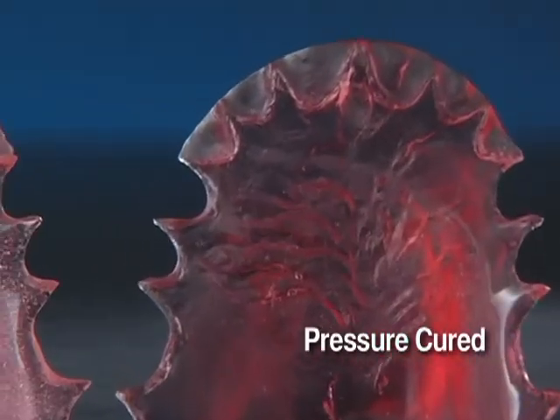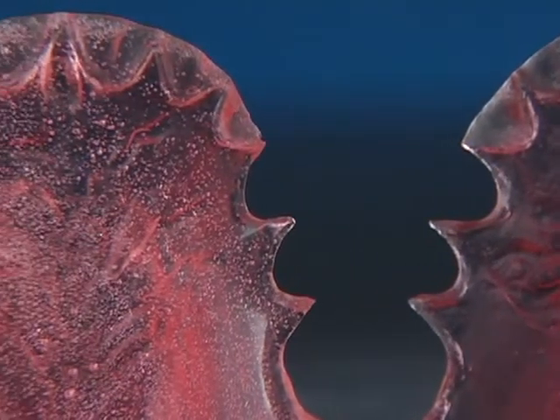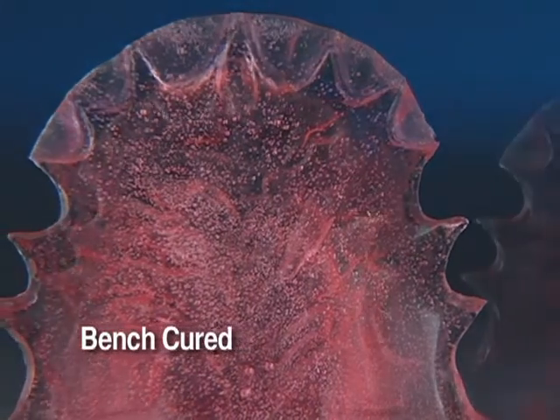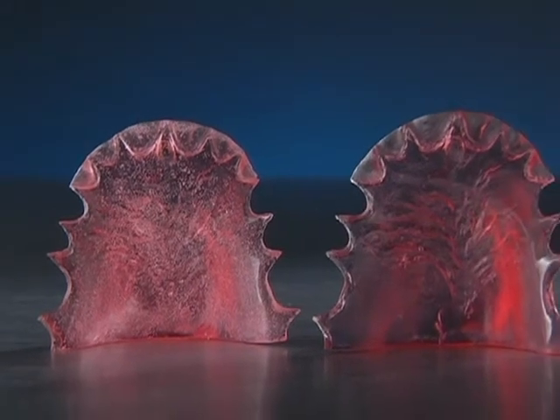See how the pressure cured appliance is porosity free, making it stronger and aesthetically more appealing than the bench cured denture. Because there is no porosity, pressure cured appliances will remain color stable.